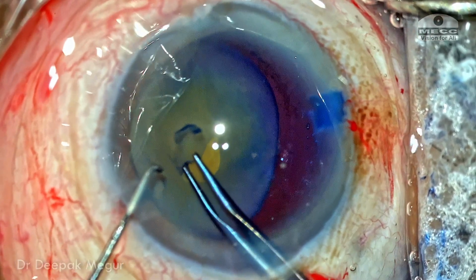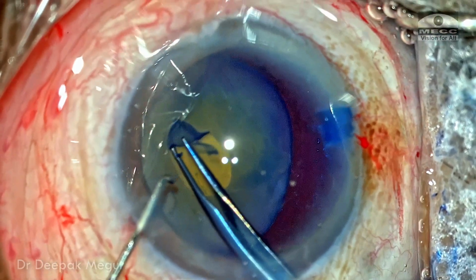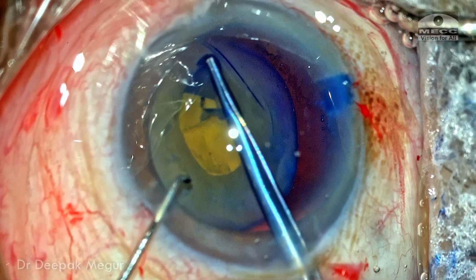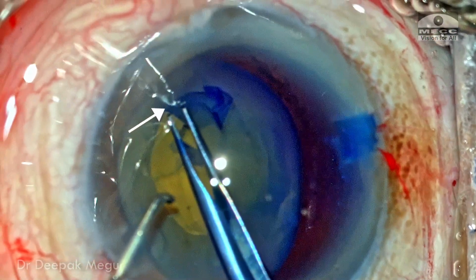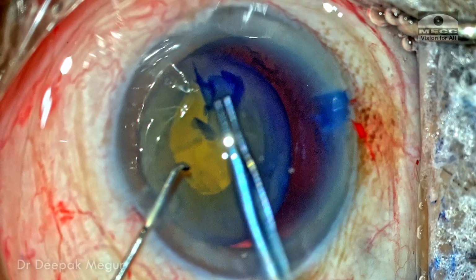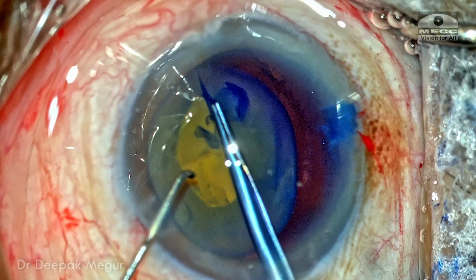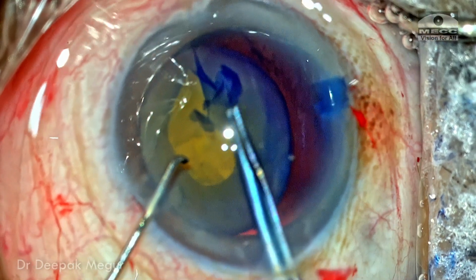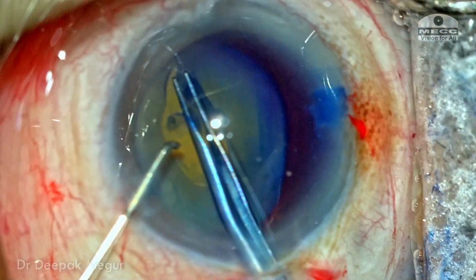As the capsular flap is being held by the forceps and the tearing is begun, initially the tearing is easy, but after some time, at the distal portion, I'm seeing these capsular folds. And as the tearing is being done, at this area, I'm feeling that the tearing is not easy because the capsule is attached to the underlying nucleus. Nevertheless, I continue tearing, but in this area the capsular folds are too much and it looks like the capsule is not tearing in a controlled manner. So this is the area with profound zonular weakness. I just leave the flap, make it flat, and then try to re-grasp it again.